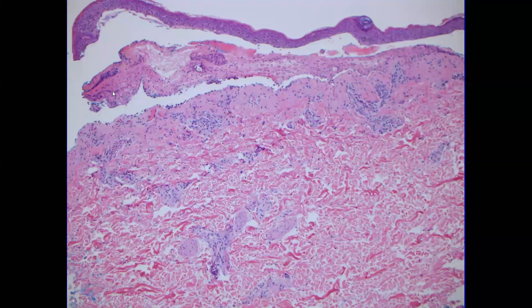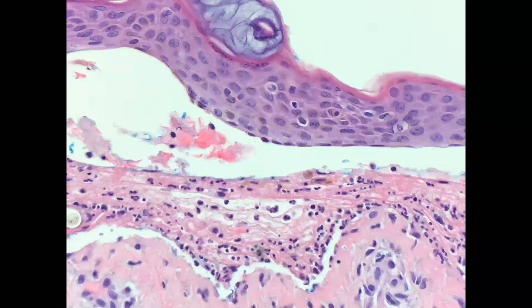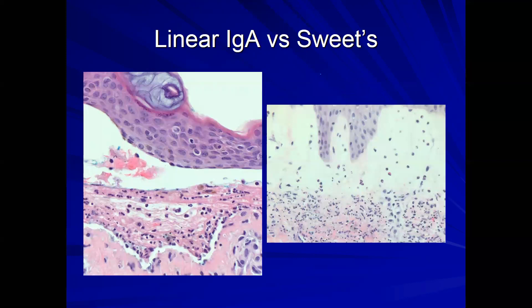Here's a subepidermal blister with fluid and a clean split epidermis, with blister fluid filled mostly with neutrophils — making you suspicious of a neutrophilic autoimmune blistering disorder. Direct immunofluorescence is needed to confirm these diagnoses. In contrast, blistering disorders with a lot of dermal edema — such as Sweet's syndrome — show a dense neutrophilic infiltrate with strands being pulled apart through the fluid. That's what edema blisters look like, versus autoimmune blistering disorders with a clean separation.